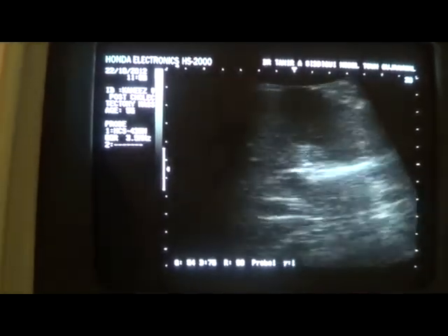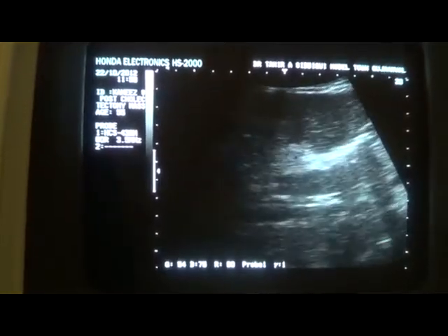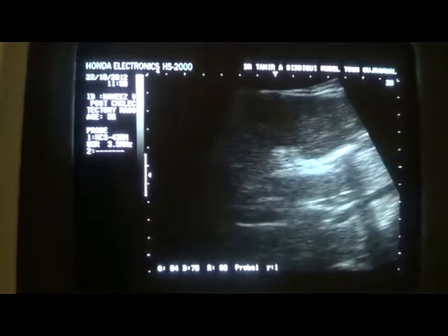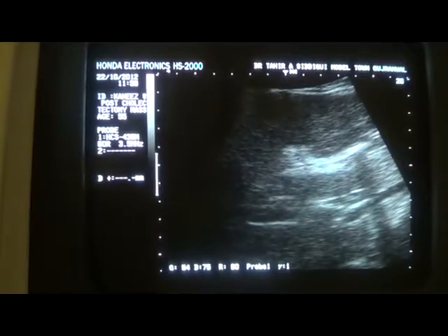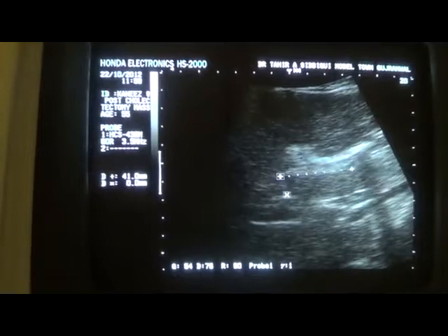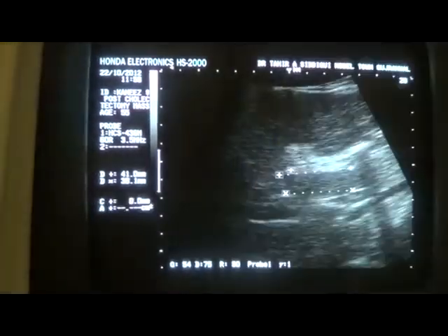And the CBD can be traced to its most distal end, and even at this stage, this is the portal vein and this is the common bile duct. It can be traced up to the inferior border of the head of the pancreas, which is this one.